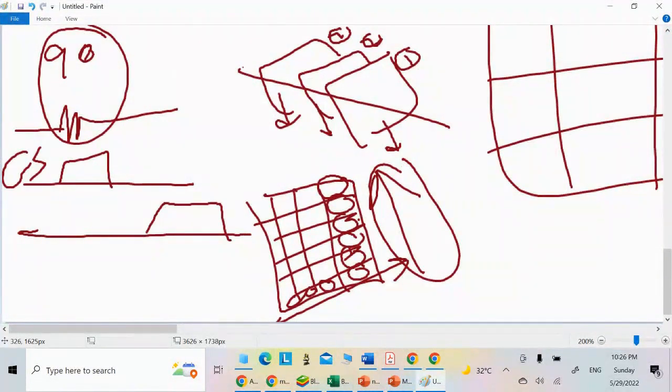They will work with specific degrees. What are these degrees? They will work with angles at certain stepping angles. For example, sometimes at 0, sometimes at 100, and sometimes at other values. Each time they will angle the gradient, and each time it's as if they are capturing a signal from a specific line, a single row of your image. Okay?